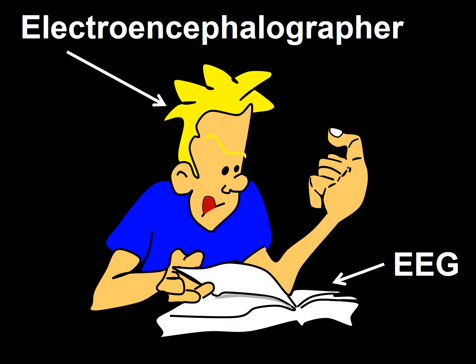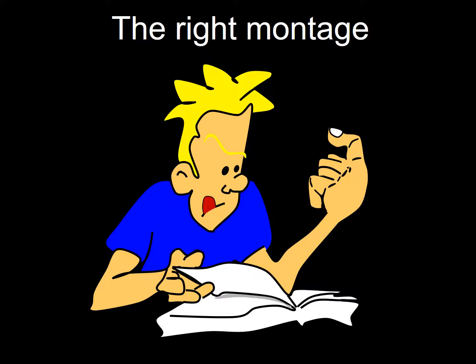So it derives from what I have just said that an important aspect of EEG interpretation is localization of the voltage source, and that using the right montage is important to achieve this goal. This task, that is the task of selecting the right montage, has been made significantly easier by digital EEG. Digital EEG allows us reformatting. Reformatting allows us to see the same event during the EEG review process using different montages. This was not possible with the old analog machines when paper was being used for recording.